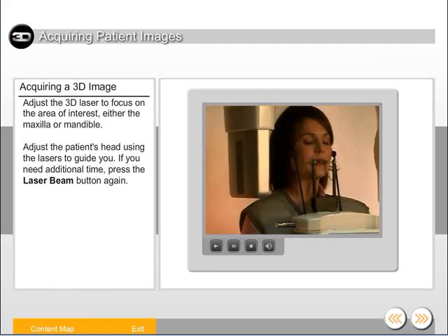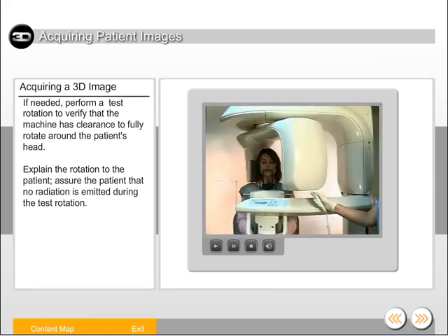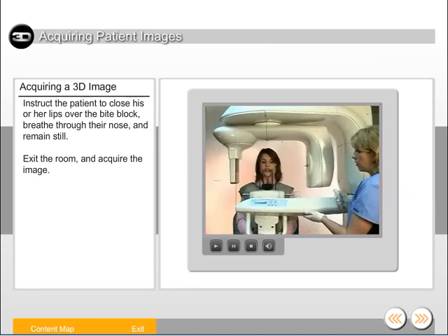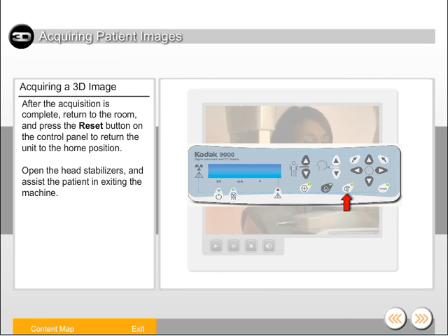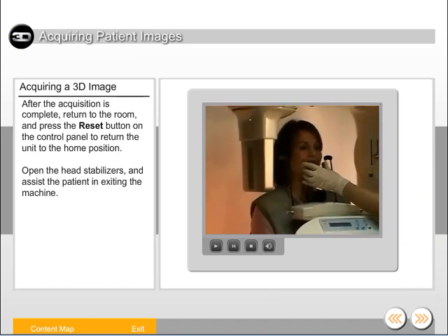Adjust the patient's head using the lasers to guide you. If you need additional time, press the laser beam button again. If needed, perform a test rotation to verify that the machine has clearance to fully rotate around the patient's head. Explain the rotation to the patient and assure them that no radiation is emitted during the test rotation. Instruct the patient to close his or her lips over the bite block, breathe through their nose, and remain still. Exit the room and acquire the image. After the acquisition is complete, return to the room and press the reset button on the control panel to return the unit to the home position. Open the head stabilizers and assist the patient in exiting the machine.